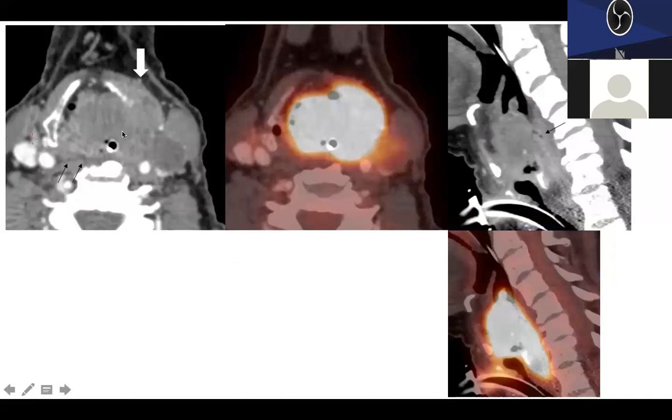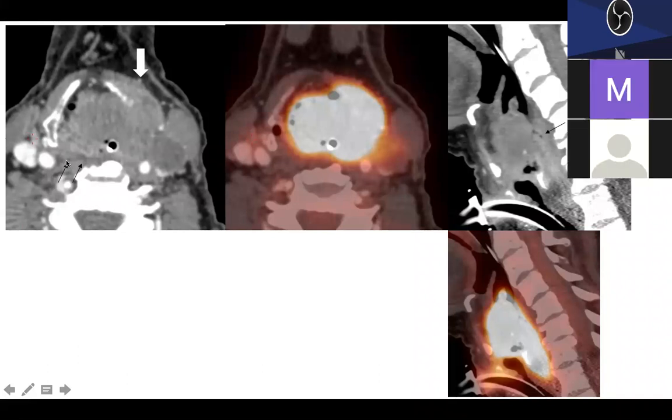Here this is a very big disease that is infiltrating, basically occluding almost the entire supraglottic lumen. You can see they had to put a tracheostomy tube also to relieve the obstruction. And there is gross thyroid cartilage erosion and extralaryngeal spread. However, in this patient also, the prevertebral space is probably not infiltrated. Here you can see this fascial lining. Here also you can trace it, sort of.